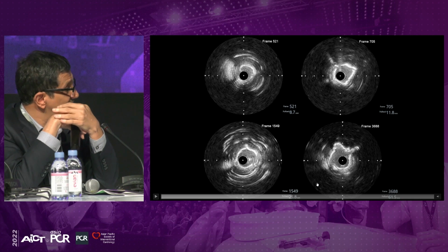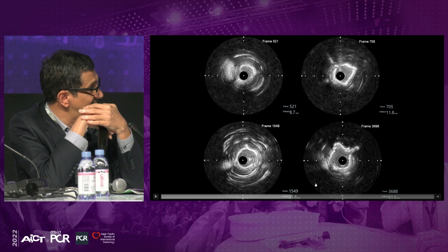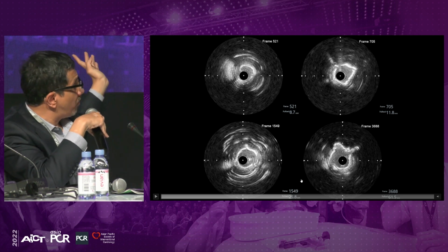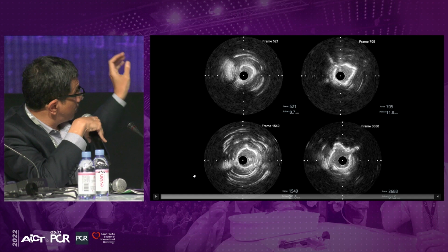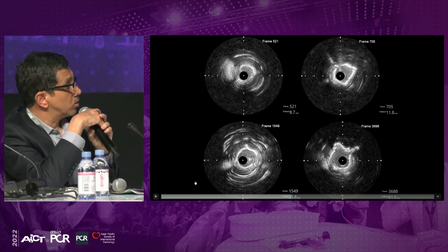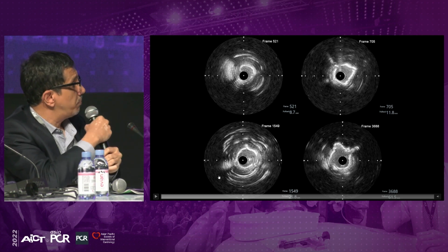or I think still more atherectomy. I'm thinking that we need to upsize the burr, because this is not only about modification but debulking. We need more debulking. Of course, at the proximal part maybe the balloon is going to work, the lithotripsy is going to work, but I'm afraid that it will not work at the mid part.